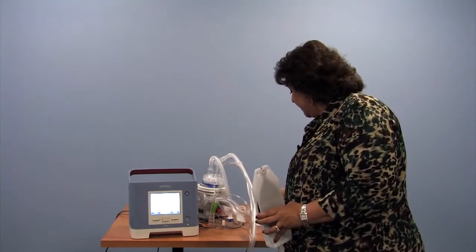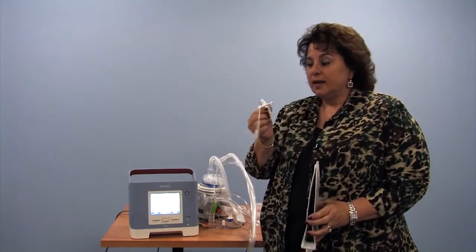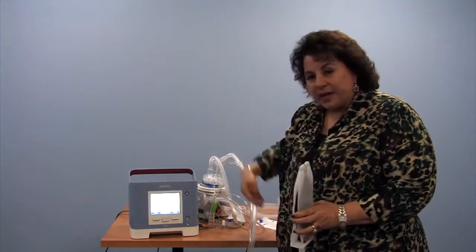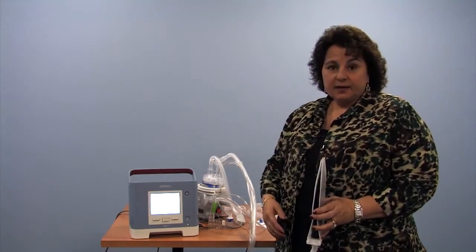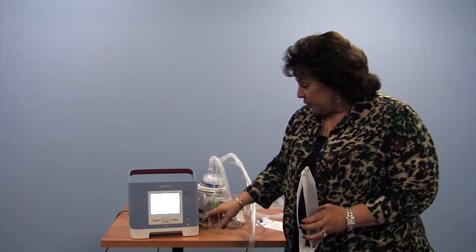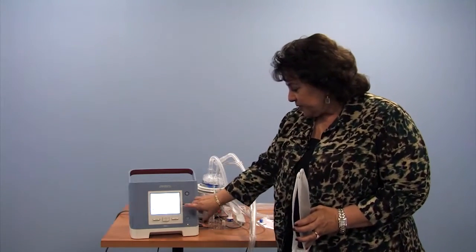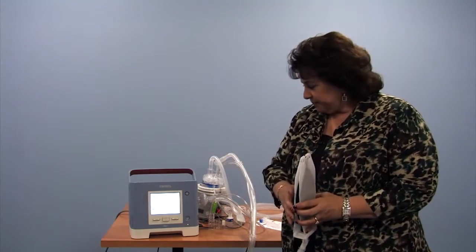A tracheostomy tube in the neck into the lungs, the same BiPAP is referred to as pressure support ventilation. So our patient has a mix of pressure support and mandatory breaths of 8 breaths a minute. So this machine is watching for us all the different numbers. It's watching the amount of air in a minute and the breath rate.